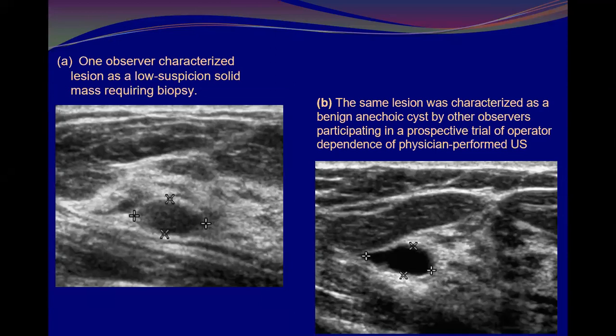If you are talking about the focal zones, what it will affect, it will be focalized. Yes, focal area. Now you are talking about the TGC, so you are talking about the grayscale, the dynamic. Yes. Okay. The TGC.